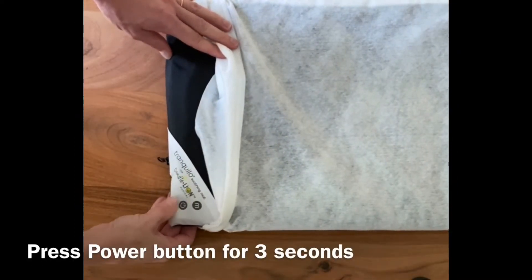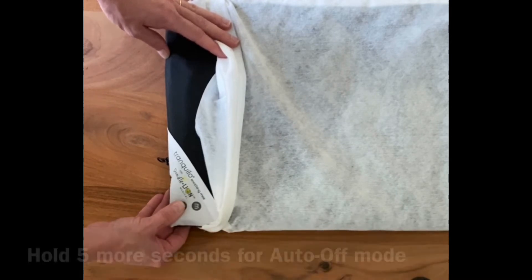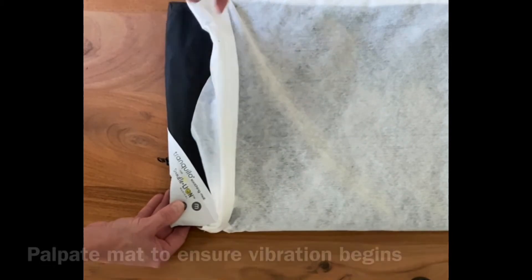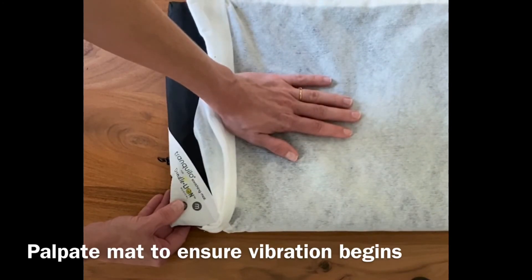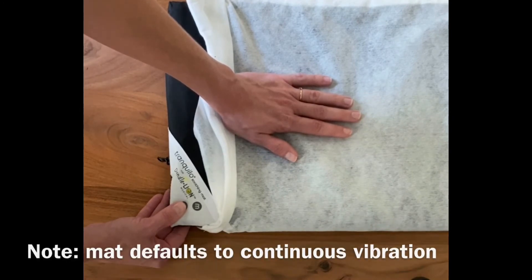Hold the power button located in the lower corner for three seconds to initiate the continuous vibration mode. Or you can continue to hold the power button for five seconds after the vibrations begin to enable a 60-minute automatic shutoff function. The initial vibration mode is very low and it may be helpful to use your hand to feel it turn on. Note that it does not default to an automatic shutoff mode.